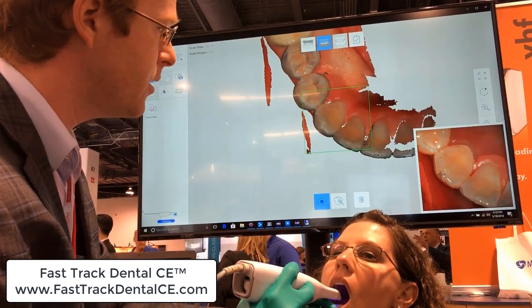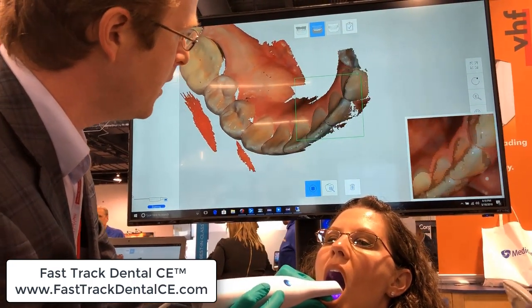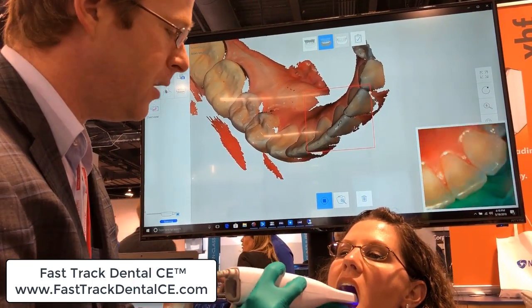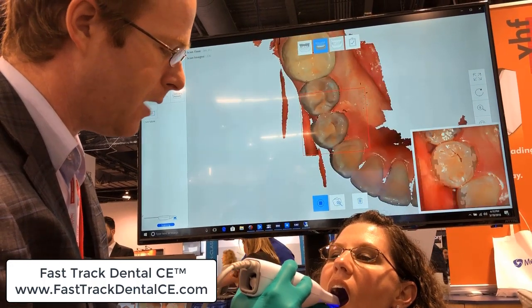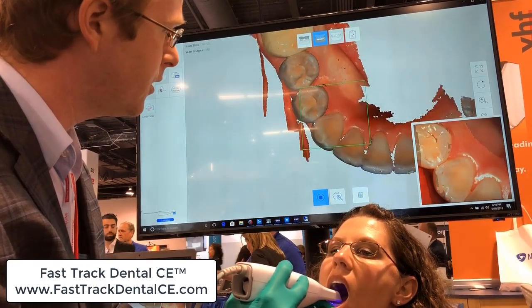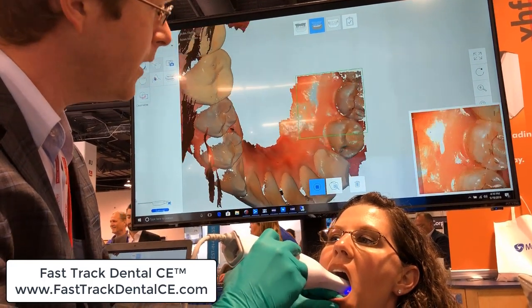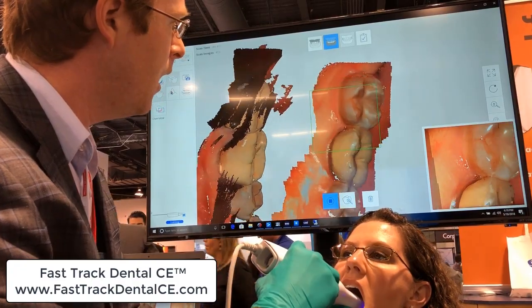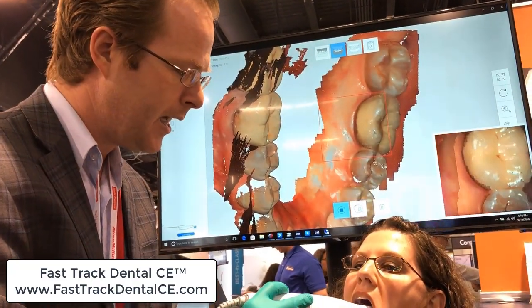Coming back to this occlusal surface, starting over here and swinging across, capturing a little bit of that facial so it'll pick up some of those anatomical landmarks. Then coming back to this surface and easily picking back up, exactly like how I would do on Trios — no difference. Sliding across, coming here to this lingual, holding at that 45 degrees, just to show you the versatility of the scanner wand and how fast this thing is.